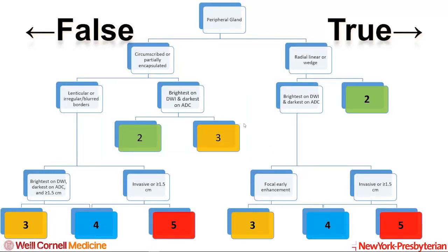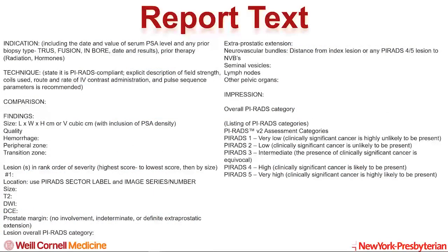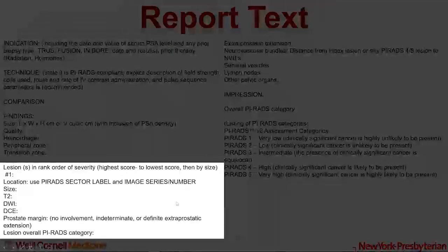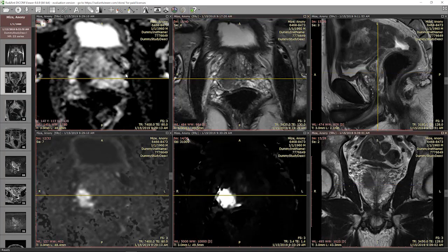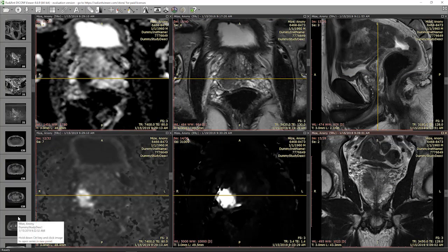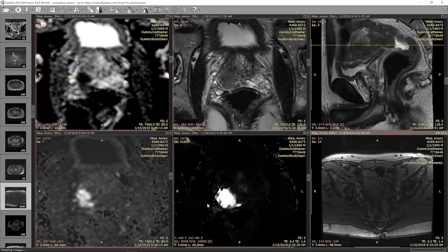Another way to think about it is this flowchart, where when a box is true you branch right, and when it's false you branch left. I'll show you how to use this to categorize lesions as we go through the MRI. This brings us to the report text — I'm going to draw your attention to how we describe lesions in the prostate. The first thing I'd like to show you is why you might want to use a perfusion map as opposed to a raw enhancement curve.